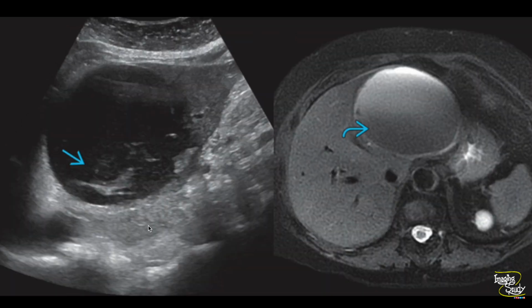Here is a longitudinal oblique ultrasound scan of the liver showing a large complex cystic structure with internal layering of debris, possibly due to hemorrhage. This patient had gone through an MR scan showing layering low signal intensity in this complicated cystic lesion on axial T2 fat-sat image, reflecting the internal blood components.